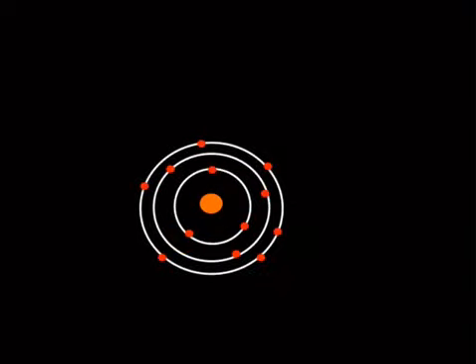So a little bit on radiation here. I have to define a vocabulary word, which is KERMA, which is an acronym for kinetic energy released per unit mass. KERMA.